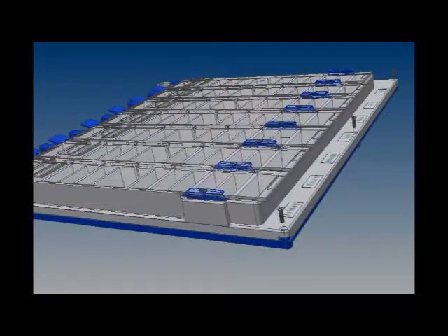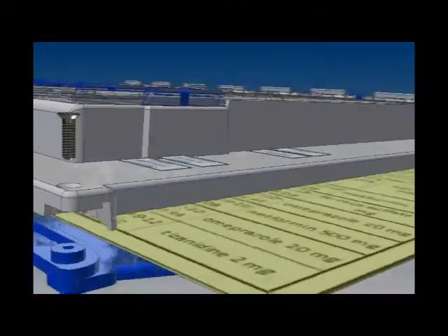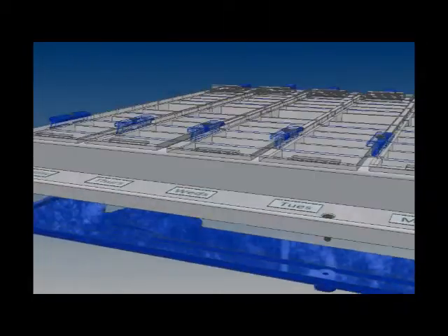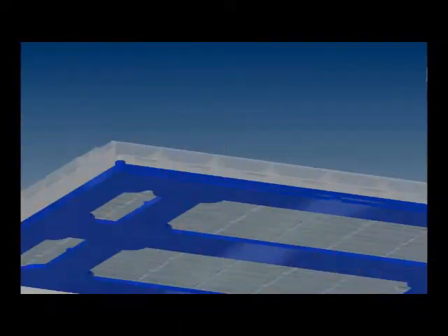The next feature we'll discuss is the pull-out. The organizer is composed of a top and bottom piece. An opening between the 2 pieces allows a piece of paper or pull-out to be slid into the organizer parallel to the columns above. Special features within the organizer help to prevent the pull-out from sliding out or falling out once it has been pushed in completely.